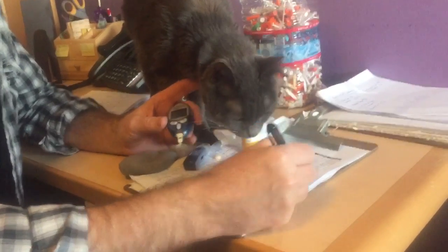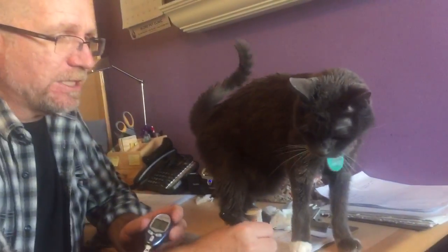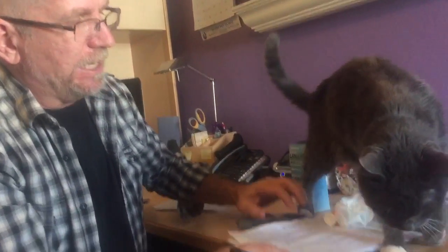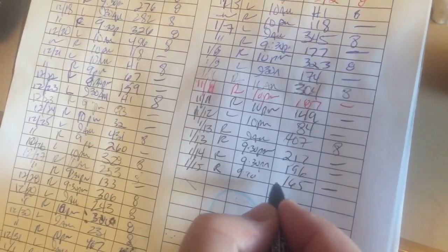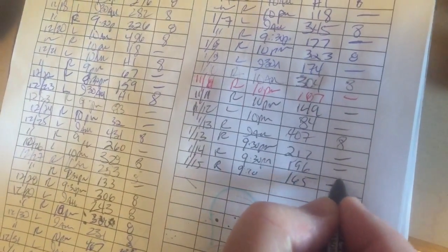We write the number down — 165. If he is 225 or below, we don't give him insulin. If it's above 225, then we give him insulin. So at 165, I'm putting a line here saying he does not need any insulin. If he did need insulin, which would be above 225, I would give him eight units.